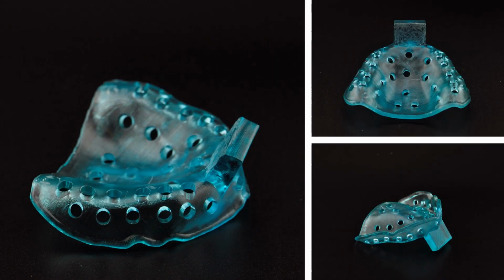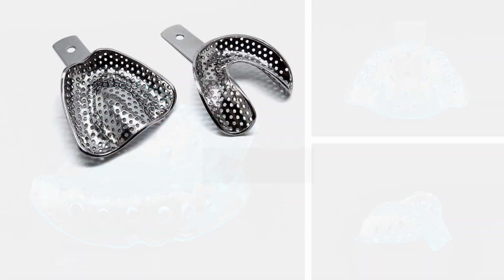You'll also receive a 3D printed maxillary tray. This tray needed to be fabricated for this course due to the modified nature of your mannequin. Other market available trays did not fit or adapt well to the edentulous mannequin, so this tray is specific to this preclinical course. It's not a requirement or necessary to be requested clinically.